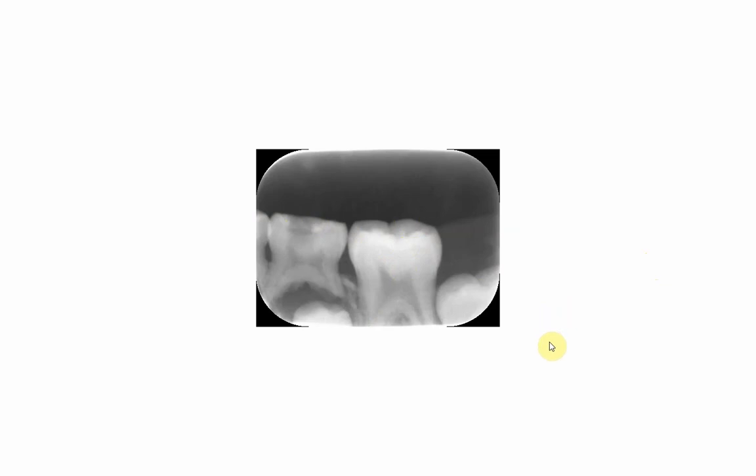And the way, if I may repeat it here again, you put your fingers on the floor of the mouth from outside in the area exactly opposite to where the film is touching, and you ask the patient to release this area. What happens is that patients, when you put the films or the sensors, when you try to push them against the floor of the mouth, as a reflex they will make all these muscles tense, which prevents the pushing down of the film in an apical direction.